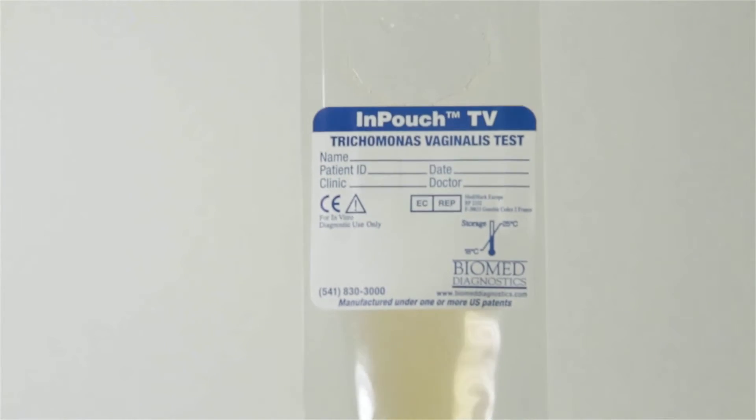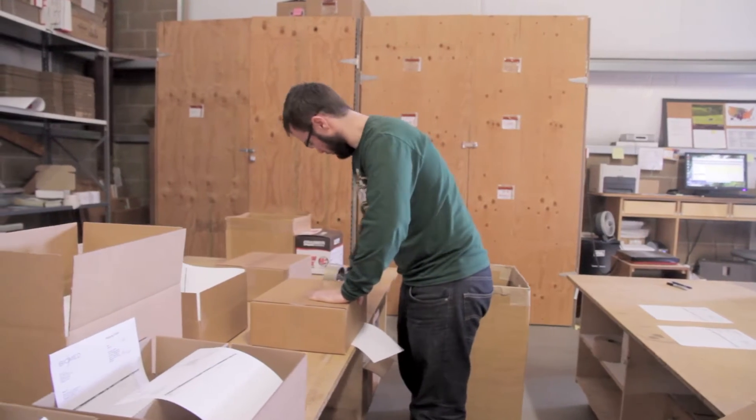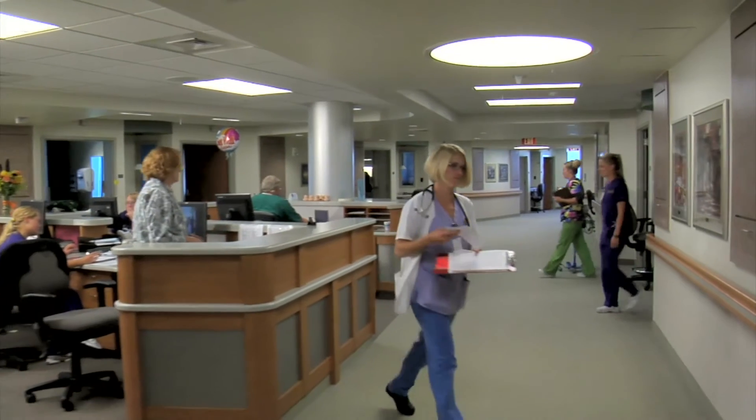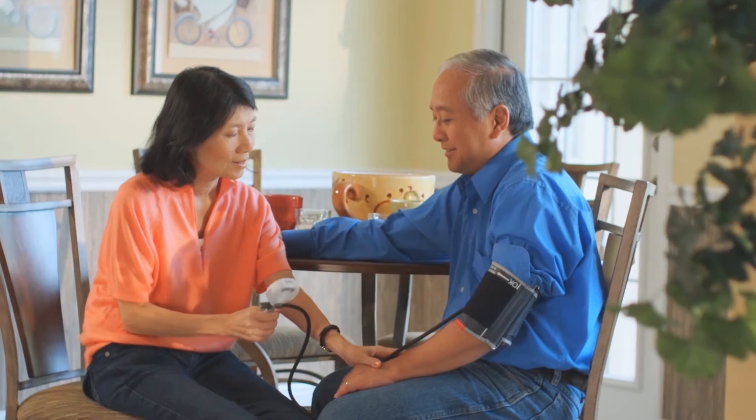The InPouch TV Kit is distributed worldwide and is widely accepted and used in clinical labs, hospitals, public health facilities, and private practice.